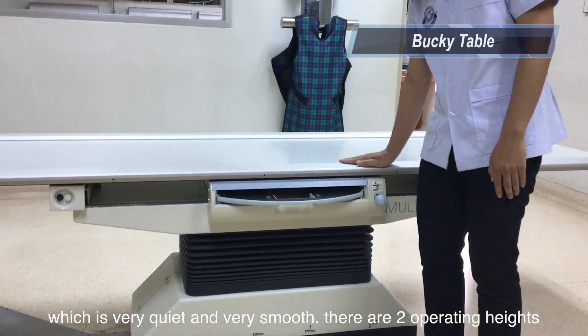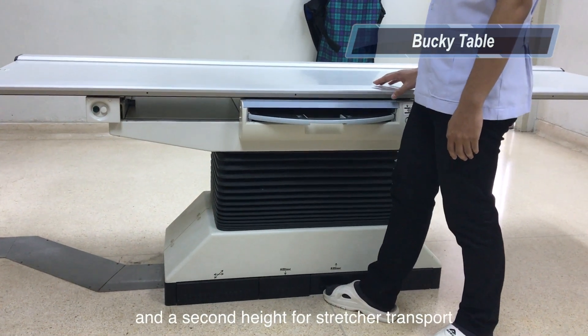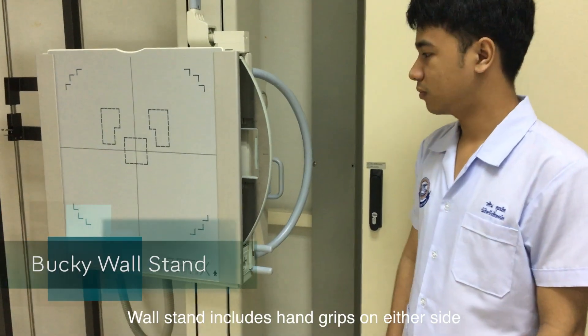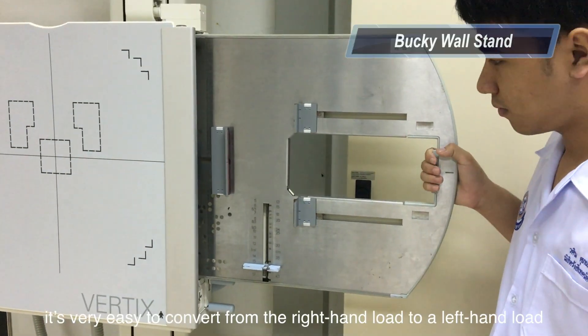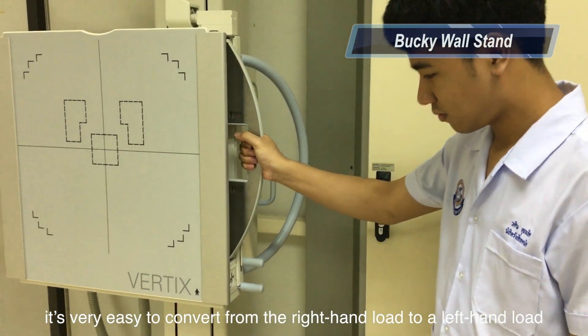There are two elevation heights. The first height is for standard elevation, and the second height is for stretcher transport. There are hand grips on either side and a lock release on either side. It's very easy to convert from right-hand load to left-hand load.